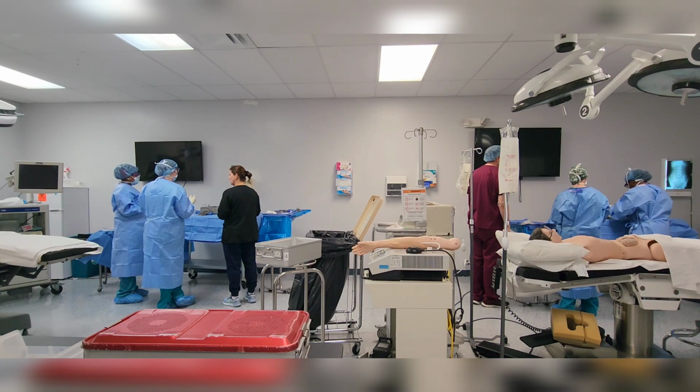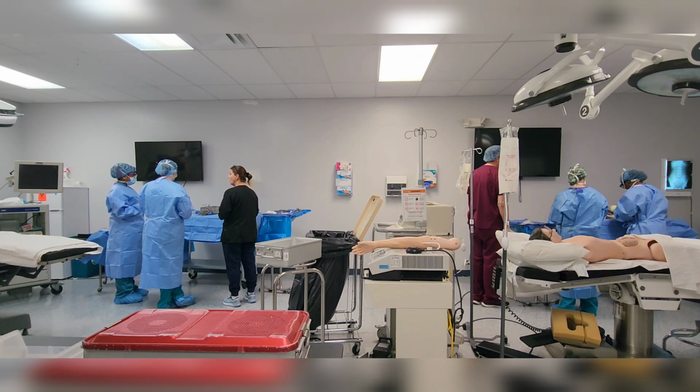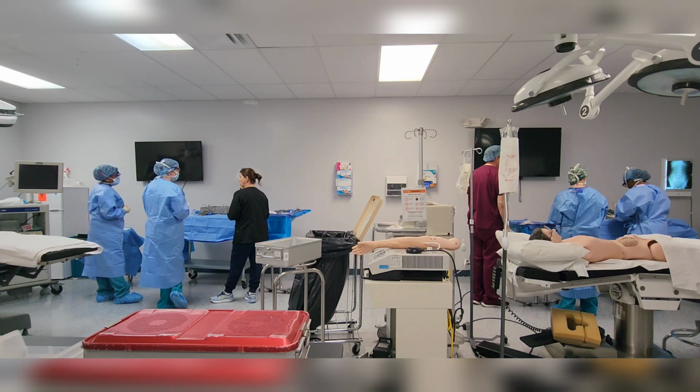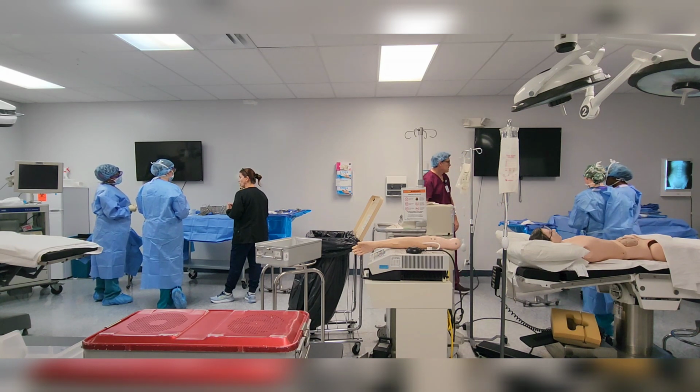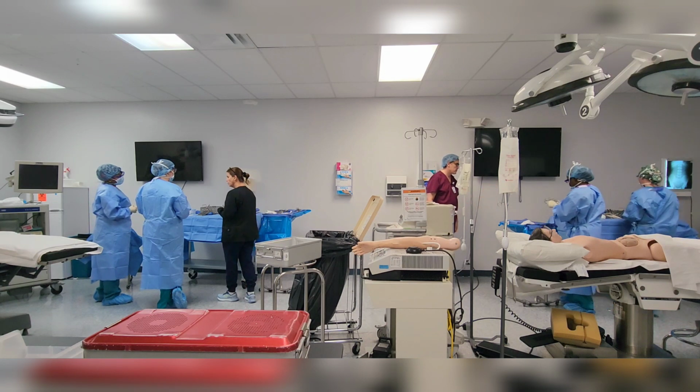You just do one. I just do one. If I know I'm doing a vaginal case, I will do multiple. So just kind of put them in the order. Anytime you're doing a hysteroscope in conjunction with a case, you're gonna want both of them loaded.